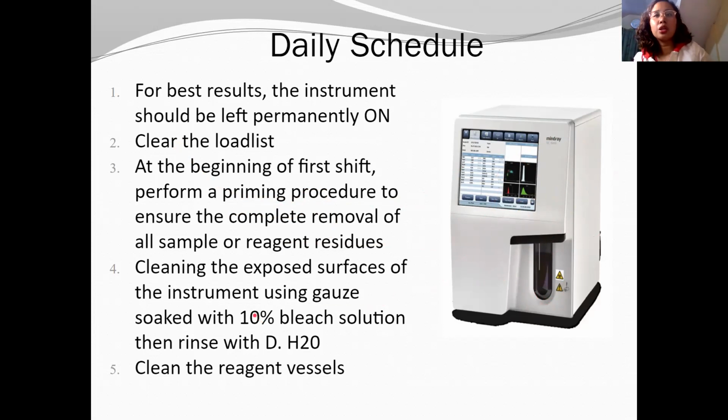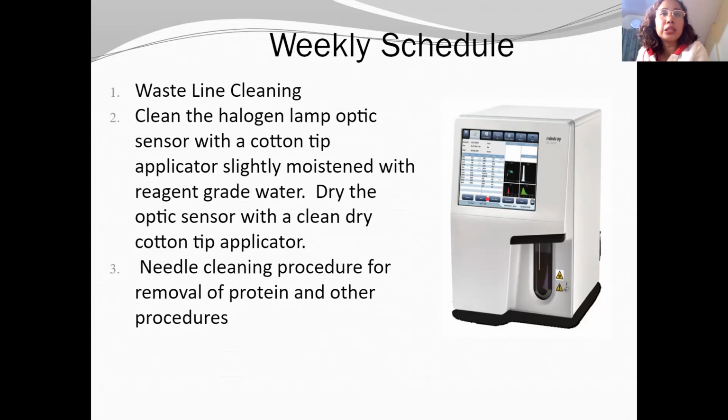What else? You have to clean the surfaces of your instrument, guys. Tingnan nyo naman yung ginagamit nyo, baka alikabok na. Wag nyo namang hayaan rin na mapuno ng alikabok. Guys, look at your laptop. Baka puro alikabok. Patikimin nyo naman ng wipes. Here sa makita natin, gauze with 10% bleach solution, then rinse with distilled water, then clean also the reagent vessels. Kung saan nakalagay, nasa loob kasing reagent vessels eh. Saan nakalagay, pwedeng palitan, pwedeng linisin.